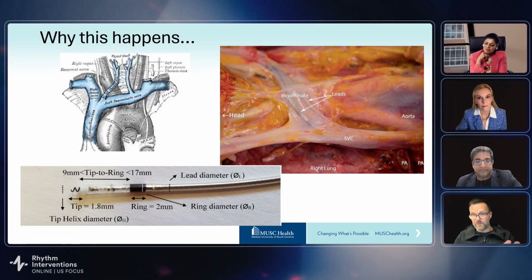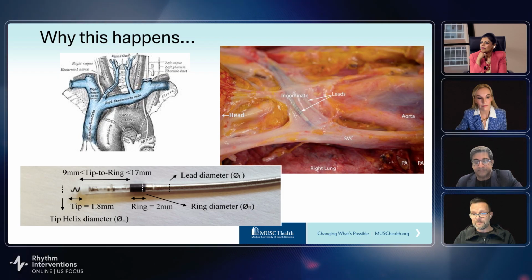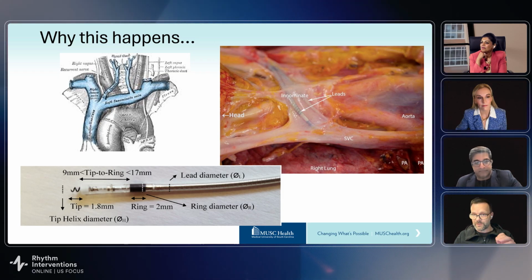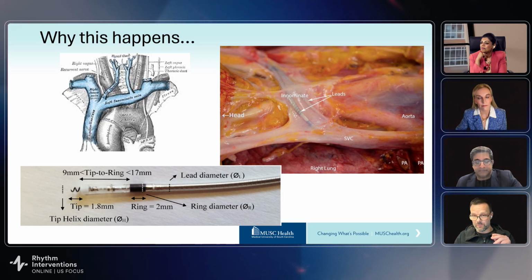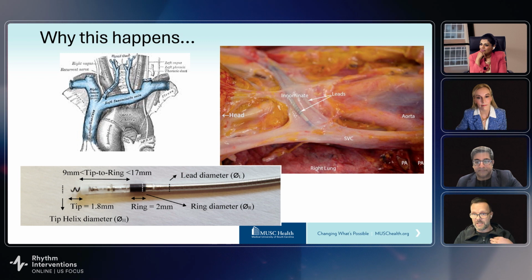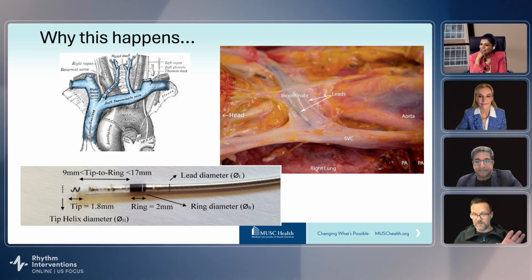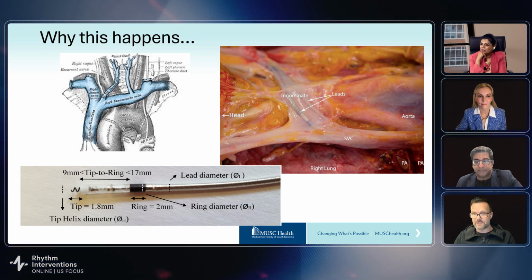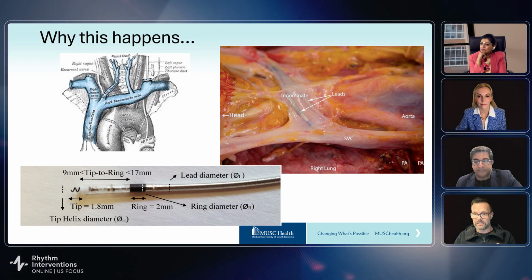I think if you do find yourself in this scenario in the field, it's really important to know what to do with the lead, right? Don't pull on it, cut it, and let it go back into the never never. That makes our life as extractors extremely difficult. If you get yourself in this scenario and the lead gets stuck, then leave the lead as intact as you possibly can. Roll it up, put it back in the pocket, and send it to your local extraction center.